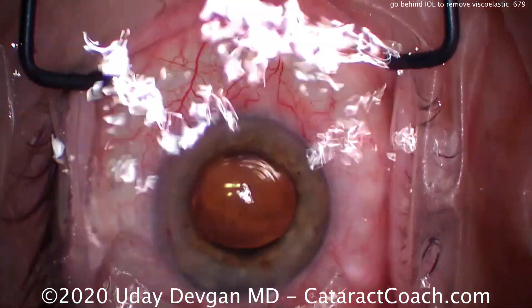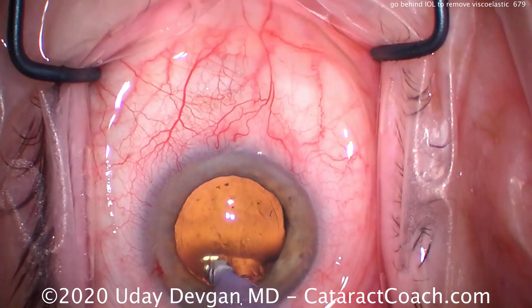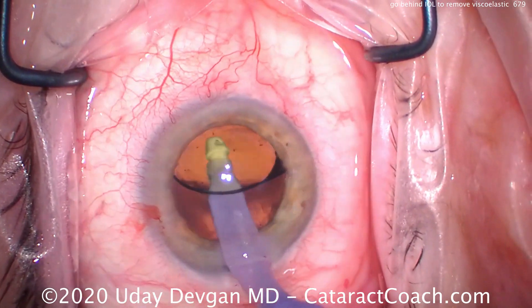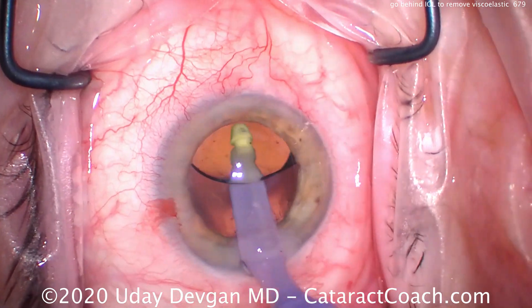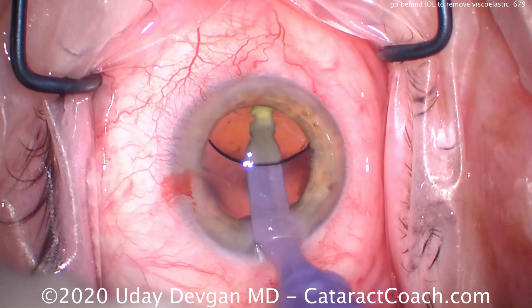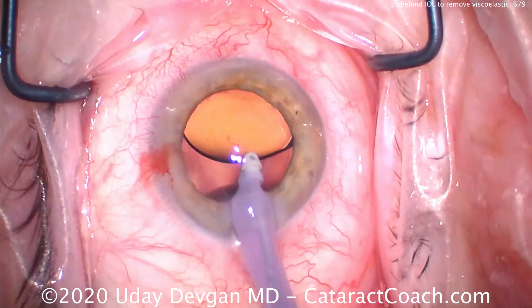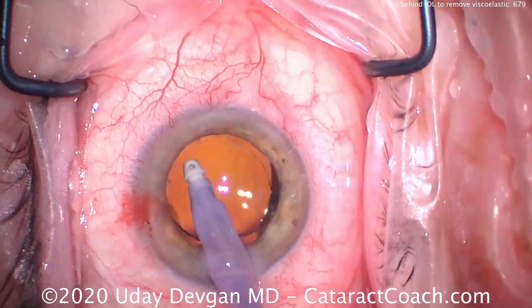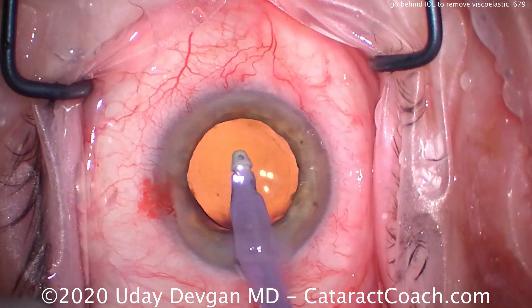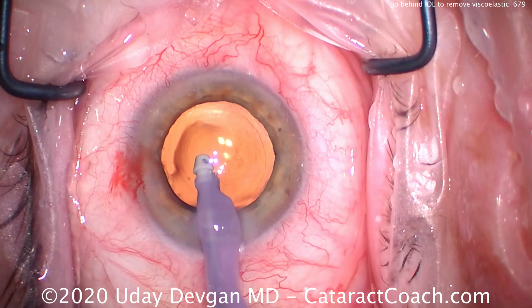Let's look at another one. Time to go under the IOL and remove viscoelastic — and again you can see there are diffractive rings. The main reason we avoid leaving viscoelastic behind the IOL is that it's going to allow that IOL to shift. If we are careful to remove all the viscoelastic from the back surface of the IOL and from the posterior capsule surface, that will allow the IOL optic to stick into position.